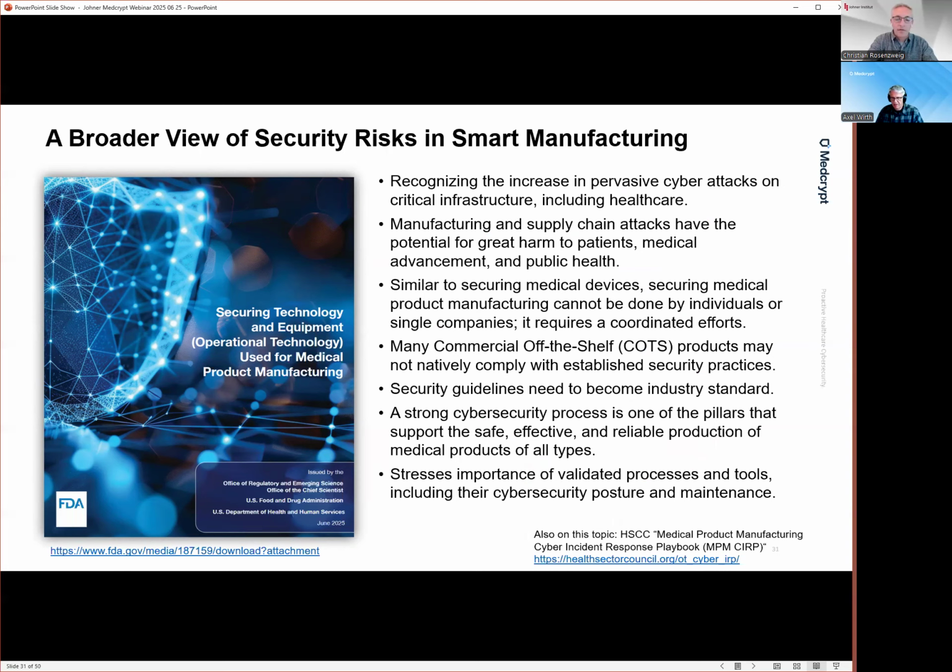And coincidentally, and I just slid this slide in here this morning, this just came out 2 days ago from the FDA, which is a white paper that actually talks specifically about impact of cybersecurity in the OT/manufacturing environment for medical product manufacturers. And this is distinctly different from the FDA product focused pre and post-market guidances. This really deals with the OT/manufacturing environment and how a security incident there can compromise the product being manufactured.